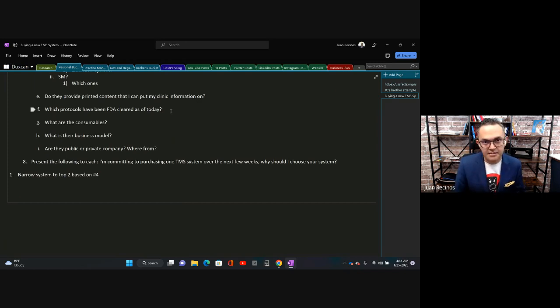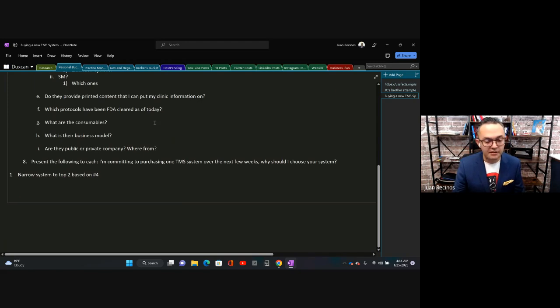Do you have any others? Have you submitted? And I realize that kind of information is more sensitive. However, you should be able to answer what protocols you have submitted for clearance, or what protocols you are looking to submit for clearance in the future. There are rules around some of that, so they're professionals and they'll share what they are allowed to share as it pertains to that. But at the very least, everybody's cleared for TRD.